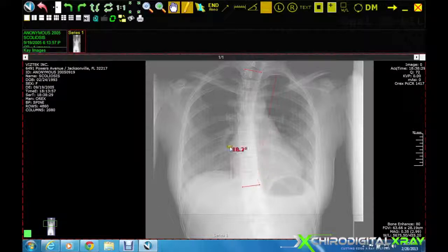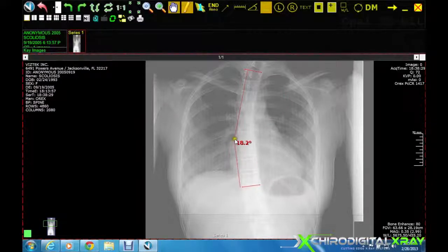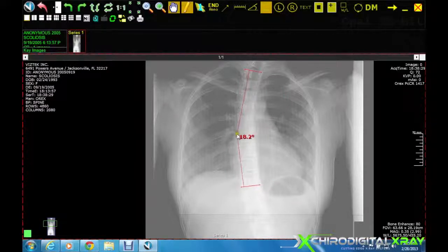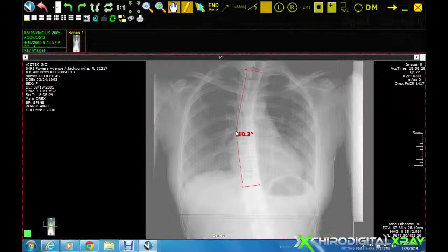Cobb's Angle is automatically displayed on the image. You can move the angle to the exact point where you would like to place it on the image.